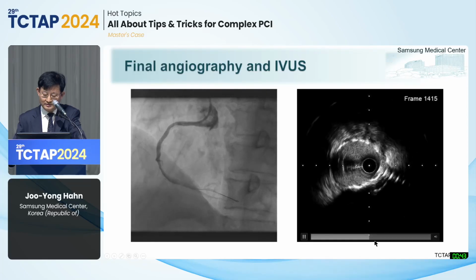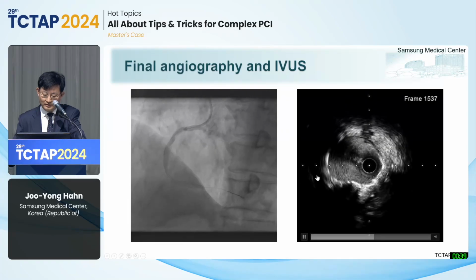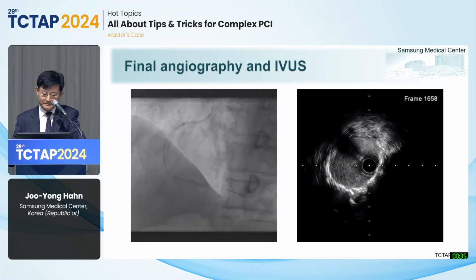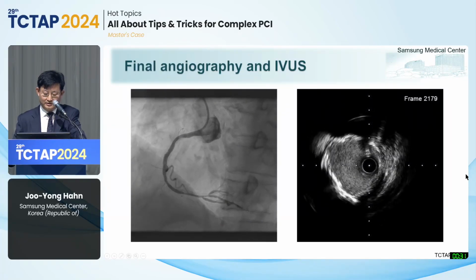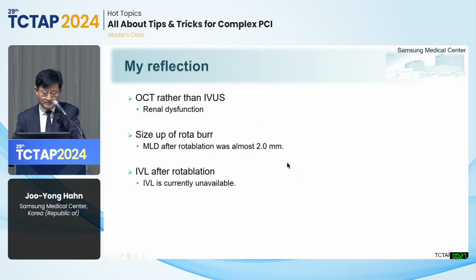improved stent expansion. So the under-expanded site was markedly improved without any serious complications. I will skip these 2 slides. So my reflections for this case are as follows.